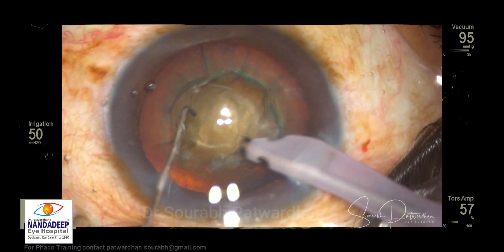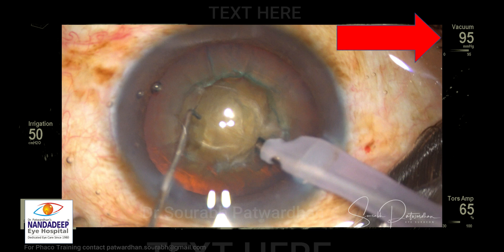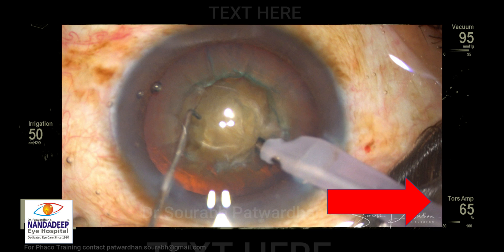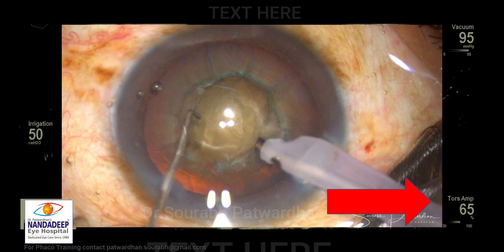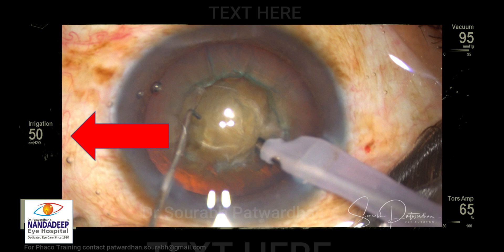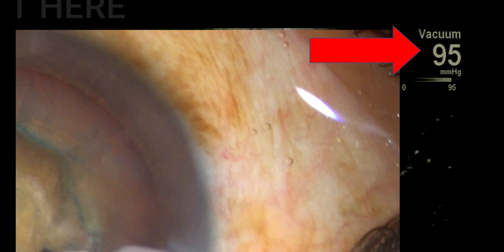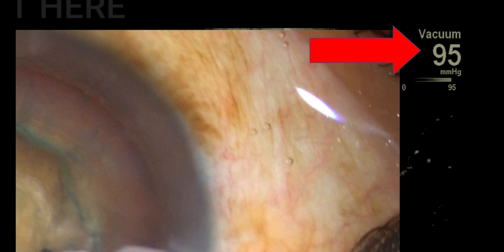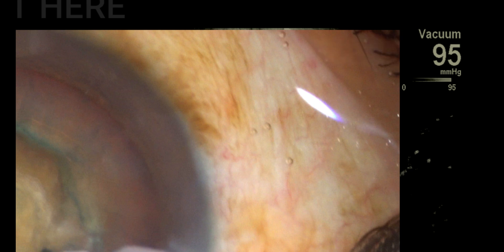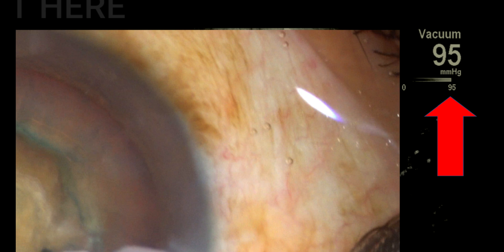Let me introduce the different parameters you will be seeing on screen. This is the vacuum. On the lower half, there will be torsional FACO, and just above that, when I start using longitudinal FACO, it will be shown as FACO power. On the left side of the screen is the irrigation pressure, which determines the bottle height in a gravity-based machine. I am using the Constellation where IOP is being maintained. The large number — 95 — shows the actual vacuum at that moment, while on the lower scale it shows it increases from zero to the maximum set of 95, and it will vary in different steps of the surgery.